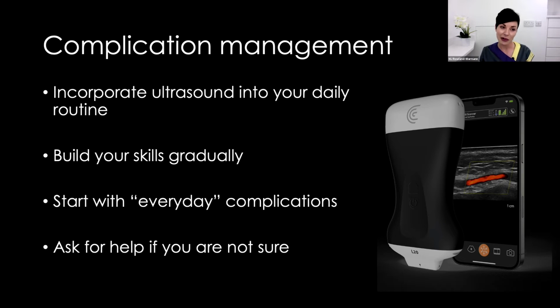Always ask for help if you're not sure. Complications can be very stressful for both the patient and for you. A second set of eyes on a case is often a very good thing, especially when you are learning. A little help in interpreting ultrasound scans can go a long way to solving a complication. And I can show you how to get there.